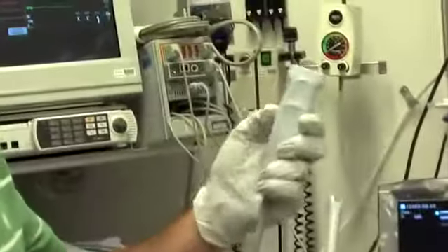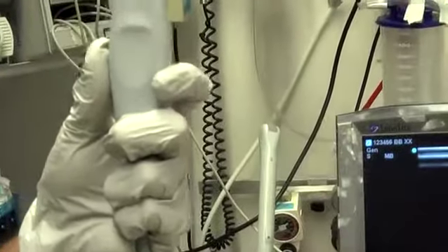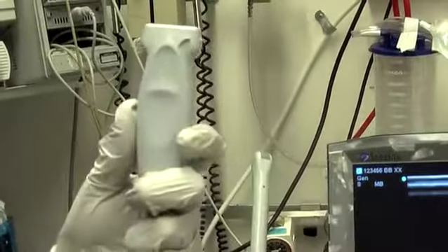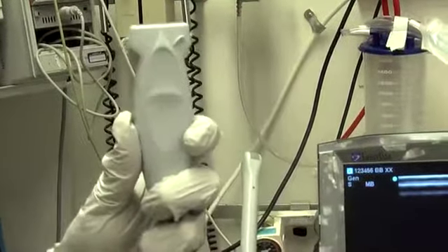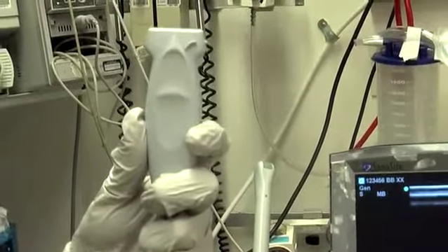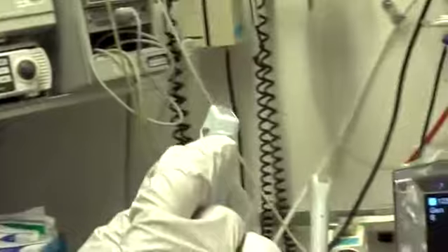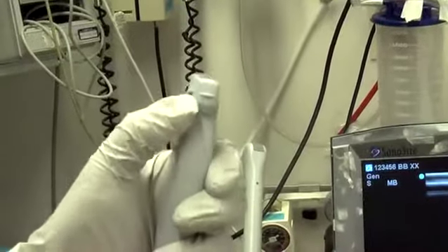This is your linear short footprint. Usually this is going to be for vascular access, internal jugular, central venous catheter placement, peripheral IV line. Probe marker here is this raised ridge. Perfect.